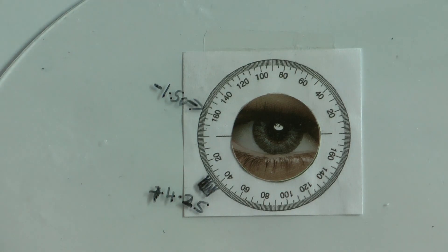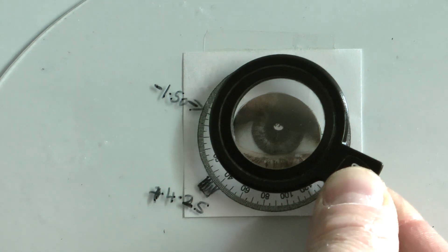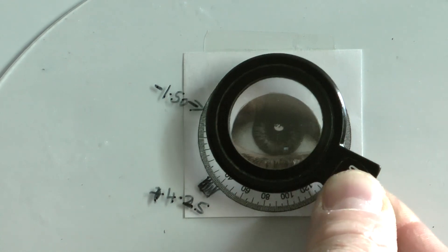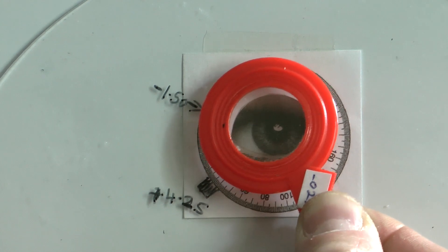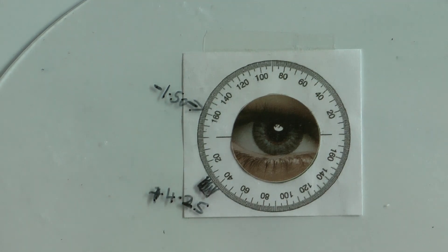When you've got the cylindrical element of the prescription sorted out, you can quickly do a spherical test while the patient looks at the Snellen chart — add a plus 0.25 just to double check. If they see the chart the same or a little bit better, then give them the 0.25. If it takes the edge off and makes it a little bit more blurred, then keep it away. Also try minus 0.25 just to make sure that doesn't bring any improvement. That's it — you've got your final prescription: plus 4.25 sphere with a minus 1.50 cylinder axis 160.